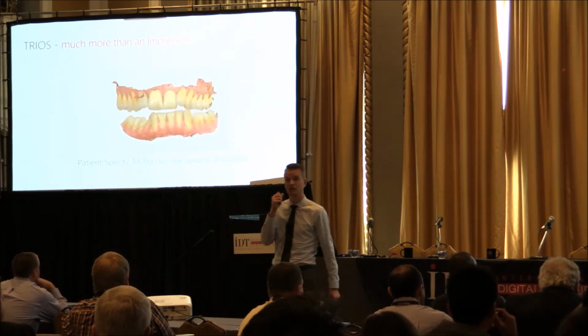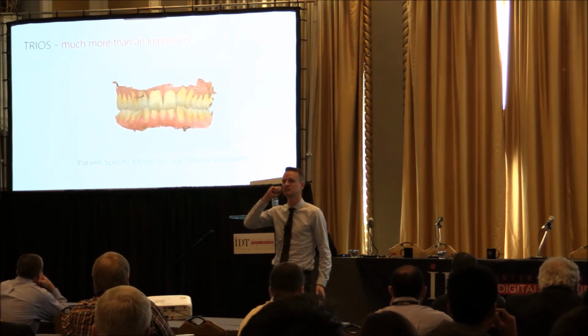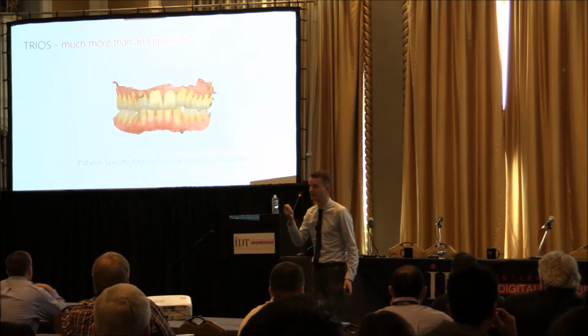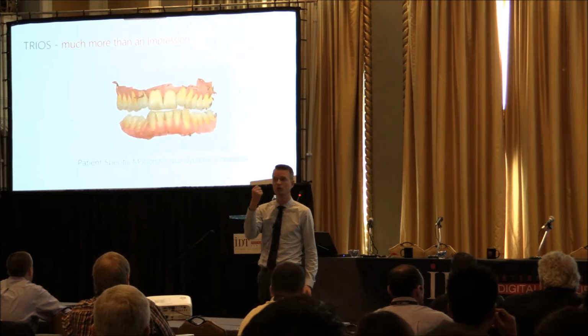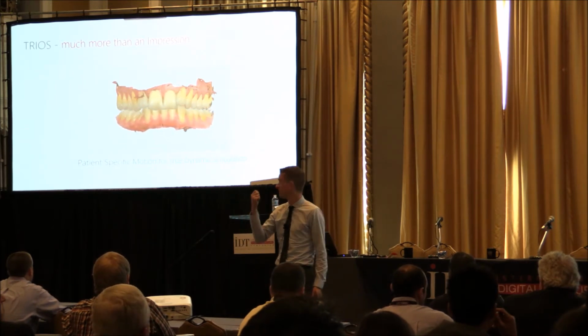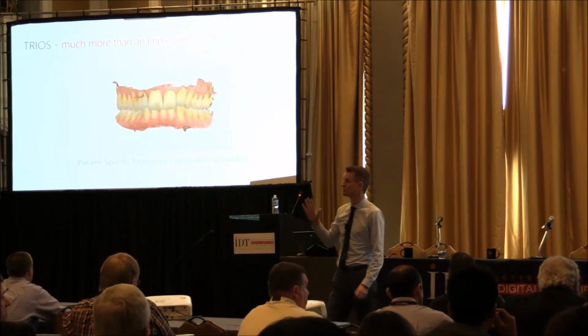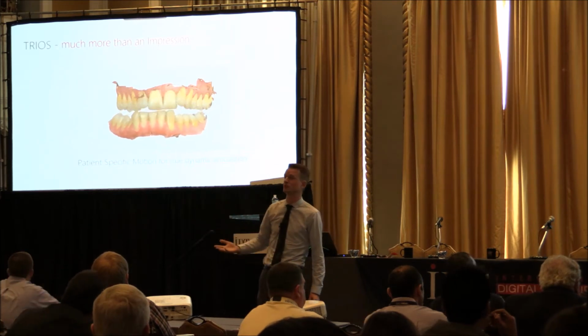You scan your upper, you scan the lower, then you put the scanner in, and you chew. So the patient is basically chewing. We promise we'll show that live at Greater New York. So if you're coming there, interview. But we can also acquire motion now with intraoral scanning. And that, of course, means that we can make much better prostheses, much better crowns, because we're going to play that motion within the CAD software.